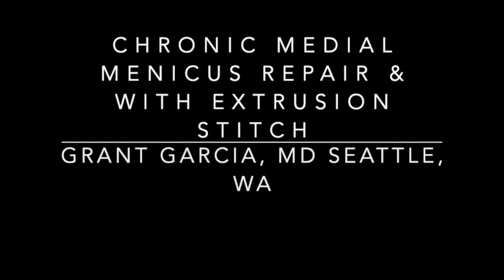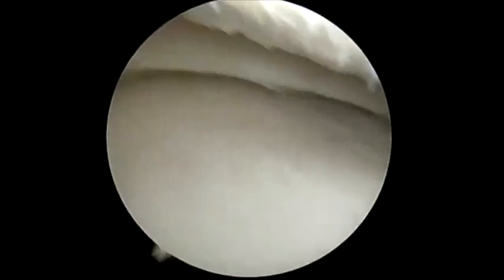Today we're going to demonstrate our newer technique to reduce extrusion in chronic meniscal root repairs. In this situation we're going to perform the meniscal root repair. You can see here this is a chronic meniscal root tear.